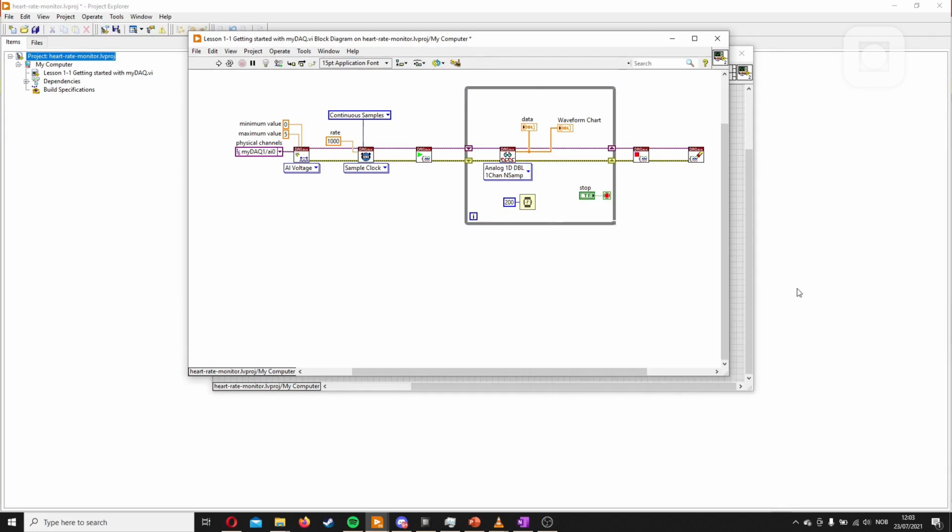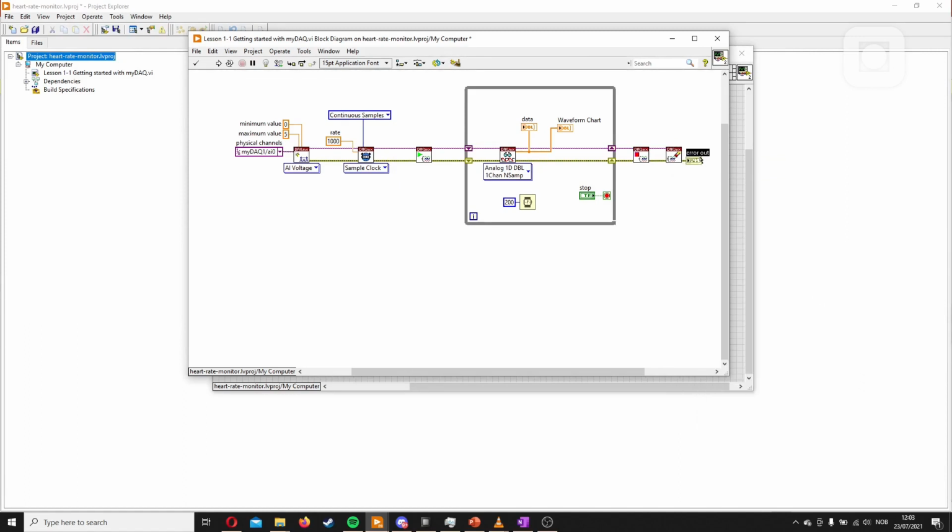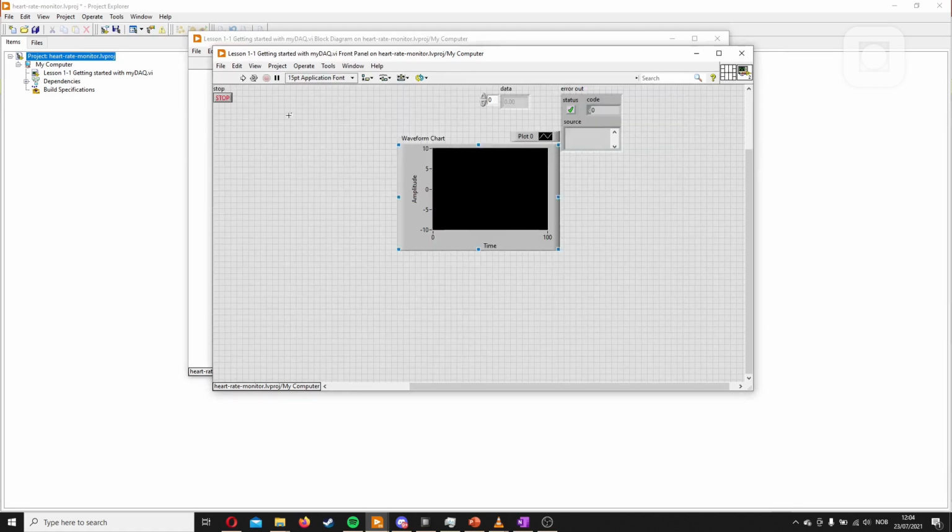We can close this one now. And then it stops. And then it lets go of the resource. We can then make an error indicator here, which will show us any errors. And save. And let's try it out.